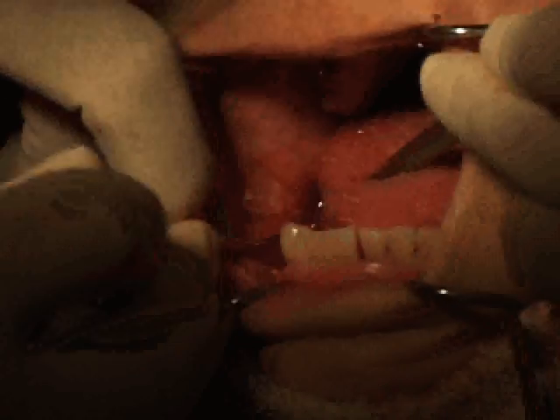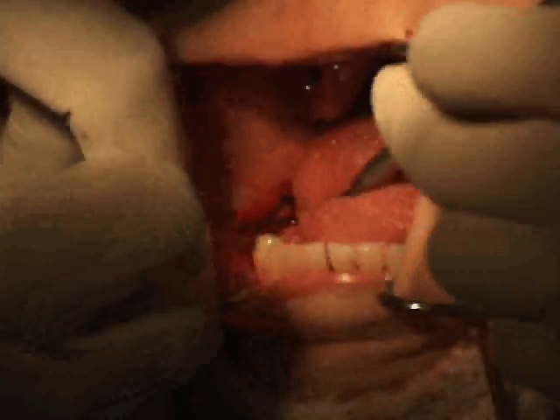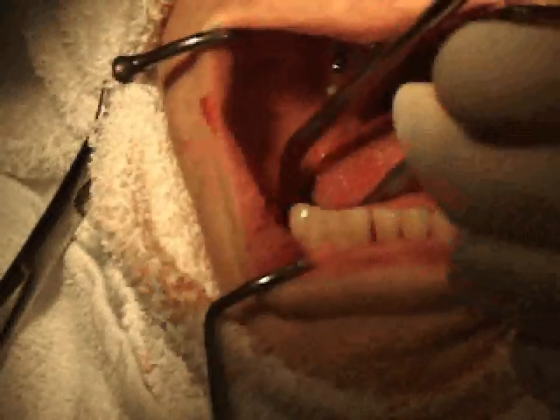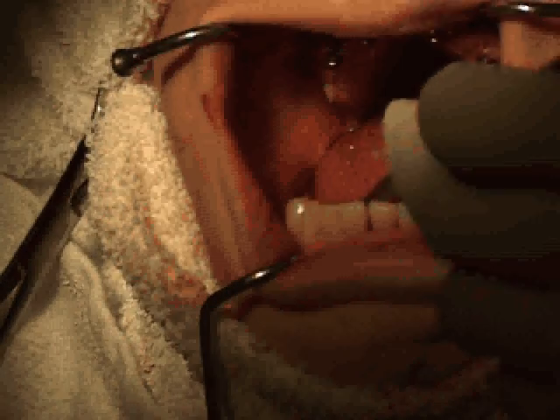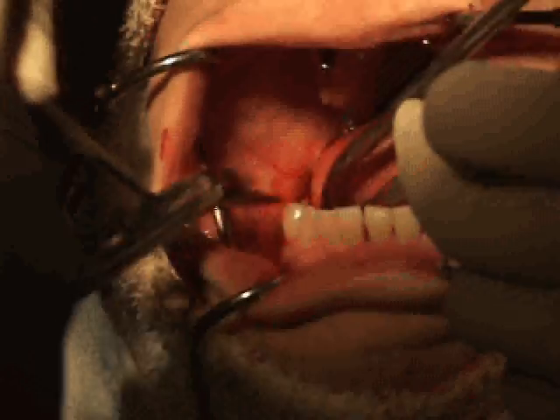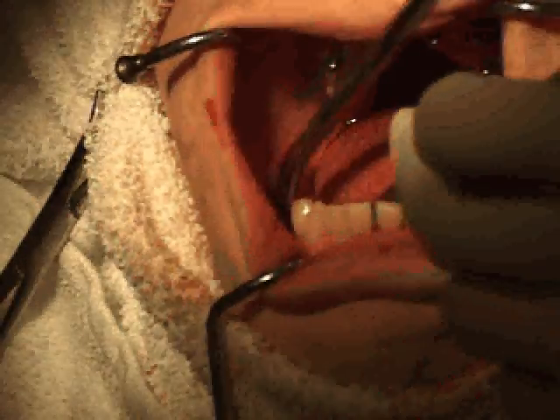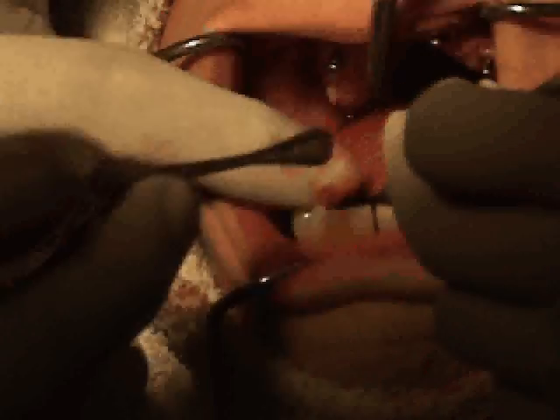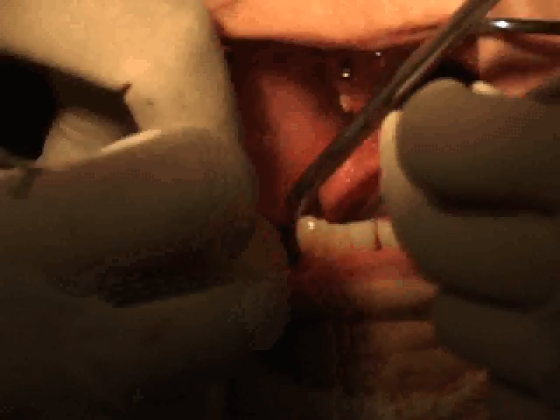And I'm very carefully reflecting first the buccal flap and trying not to disturb the periosteum, and then I reflect the lingual flap to the myohyoid muscle down into the digastric area, and then I flap the buccal up over the external oblique ridge, and trying not to bisect or reflect any of the muscle attachments over the external oblique ridge.